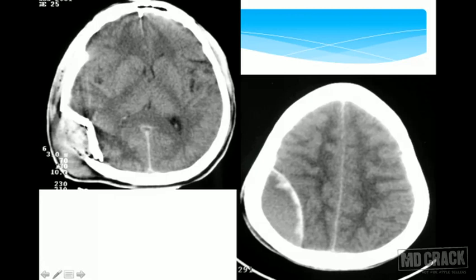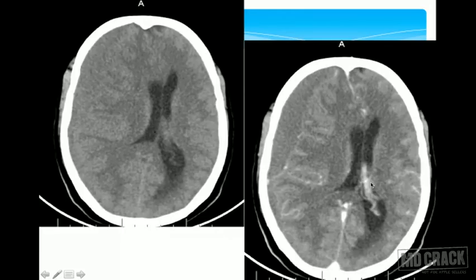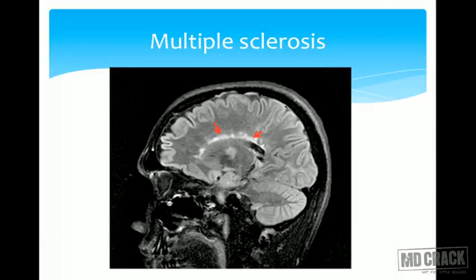Trauma case examples: a fracture of the right parietal bone is visible on CT. Another patient shows an extra-axial hematoma collection. A further case demonstrates subdural hemorrhage with mass effect, midline shift to the left, and dilatation of the lateral ventricle.